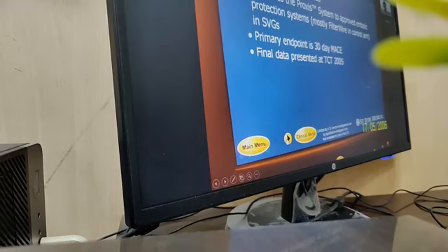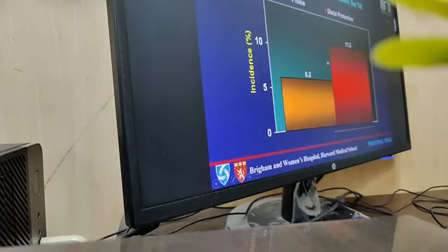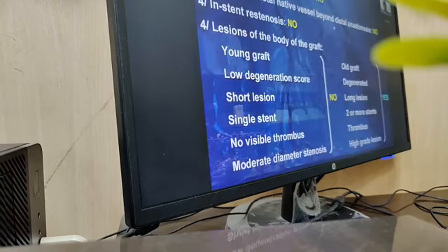The Proxys proximal trial, from St. Jude, used 600 patients, with a proximal protection test arm and a distal protection control arm. So this is very authentic, and they have shown superiority. It looked at 30-day MACE in lesions amenable to either proximal or distal protection. With distal protection the incidence of MACE was 11%, while with Proxys it was 6%, a significant difference. That means proximal devices are a little superior to distal protection devices, but you have to use them very well.